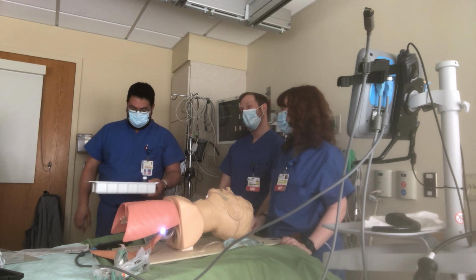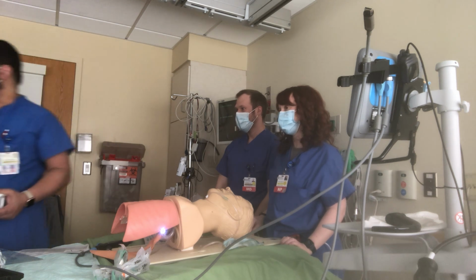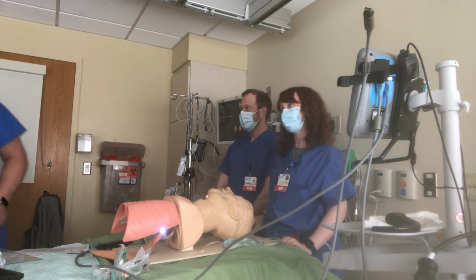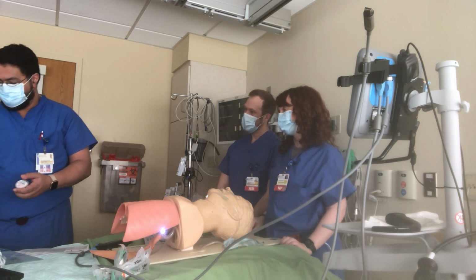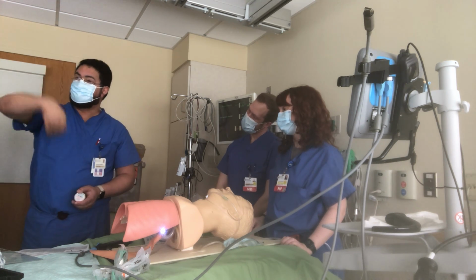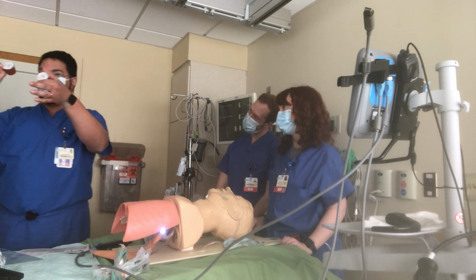Atomizer, lido? This is the same one, 4%. We put it in the atomizer. Can you bring the atomizer, Professor? This is like an old woman's perfume thing. Put the atomizer together, please. Alright, and next, viscous lidocaine. The atomizer can actually go all the way to the back and numb the larynx itself, or above the larynx. And this is viscous lidocaine.